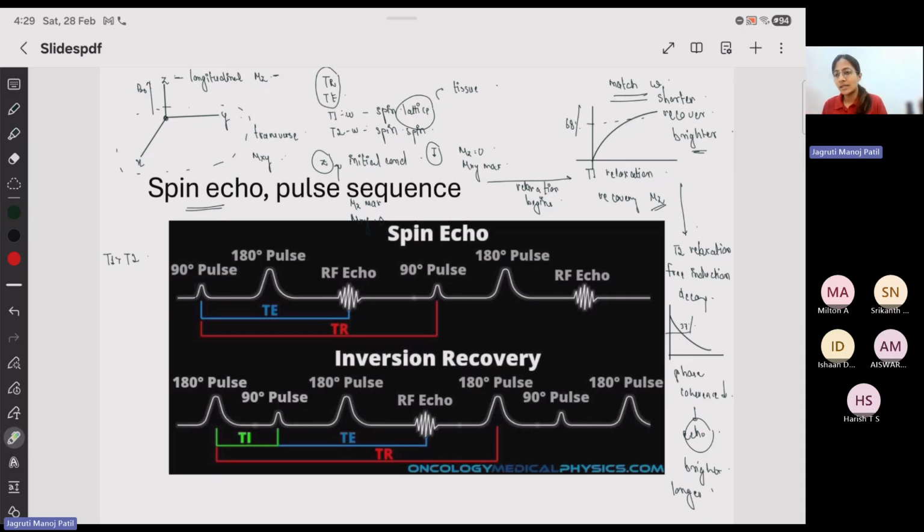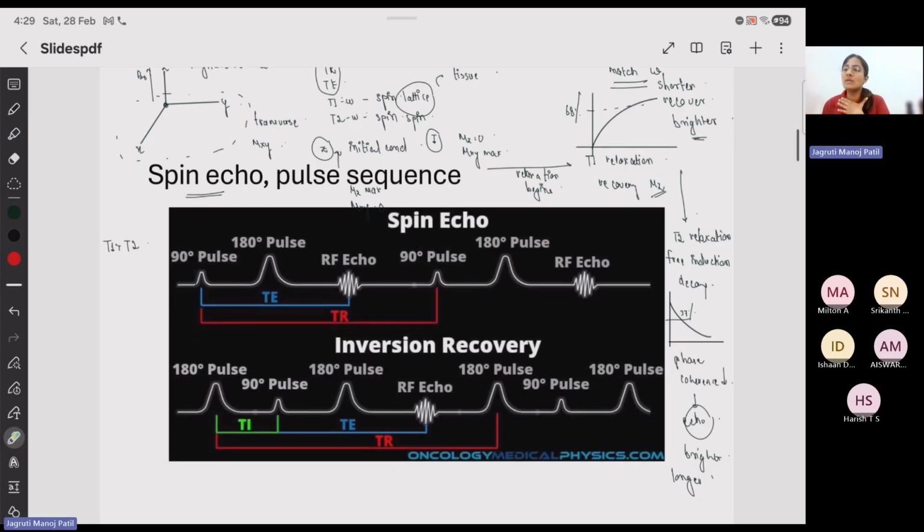So what they then came up with was a gradient magnetic field. You'll have different coils, and your entire body will go through a gradient of a Tesla of magnetic field instead of all organs at a time. Then you'll get slices of frequencies; let's say I'm trying to image my neck or my shoulder. Both of them will have different slices, and the tissues there, the scattering that I'm getting, will match up to a different Larmor frequency. That's how they see how your Larmor frequency matches up, and then how your T1 changes and how your T2 changes at that time.